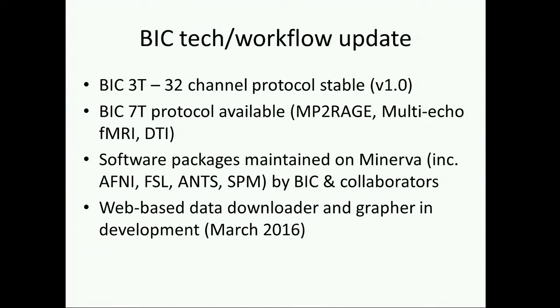Again, based on the work by BIC and its collaborators, especially on Vivora. We have all the major software packages used in neuroimaging installed on Minerva. So if you get a Minerva account and log in and type module load AFNI or module load FSL, that's the only command you need to run to get access to the software and the latest version of it that's been tested.